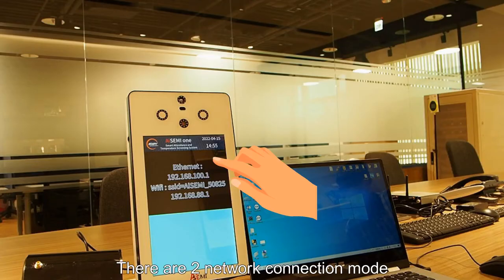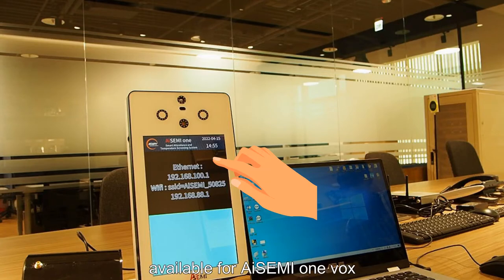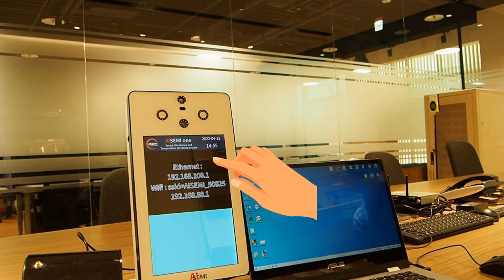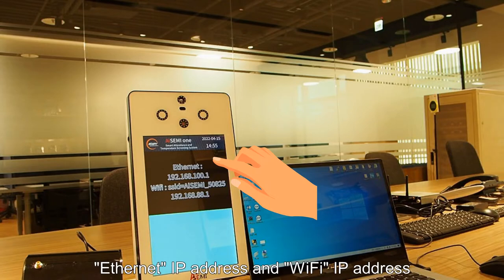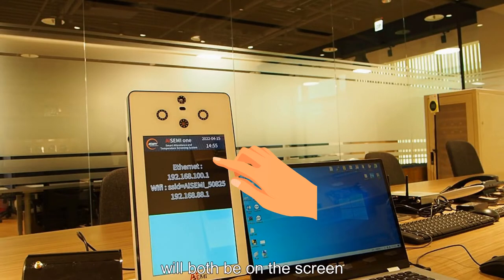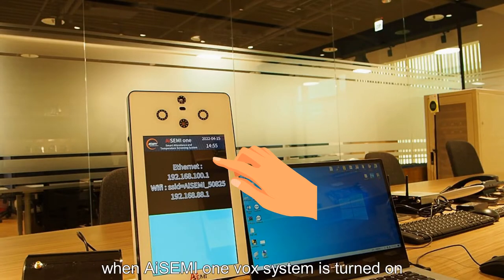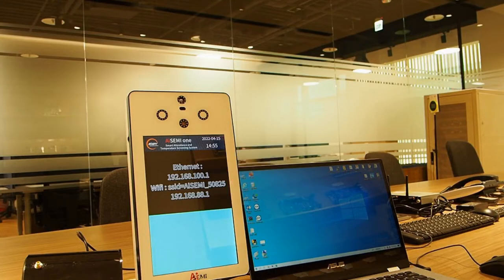There are two network connection modes available for AiSEMI one box: Ethernet and Wi-Fi. Ethernet IP address and Wi-Fi IP address will both be on the screen when AiSEMI one box system is turned on.